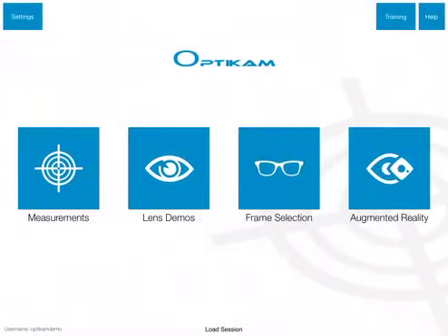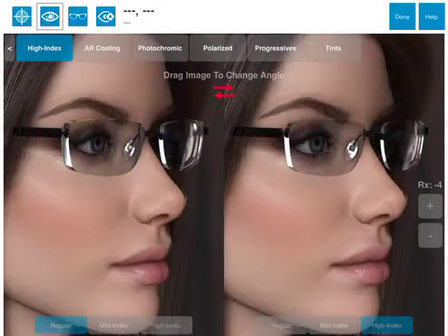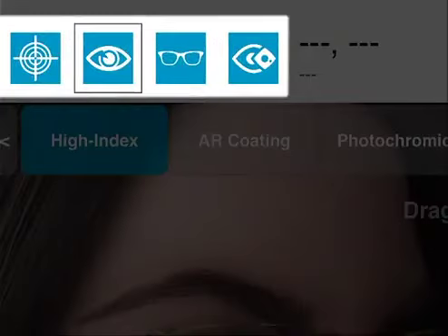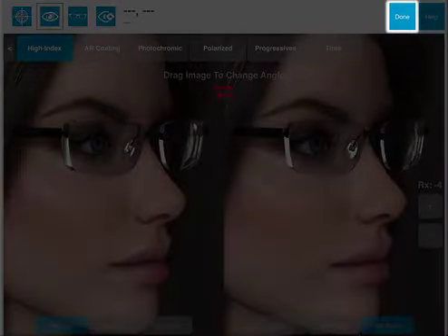4 modules are available within the app: Measurements, Lens Demos, Frame Selection, and Augmented Reality. Tapping a module icon will launch a session. You can quickly navigate between the modules in a session by using the icons at the top left corner of the screen. You can save or discard your session by tapping on the Done button.